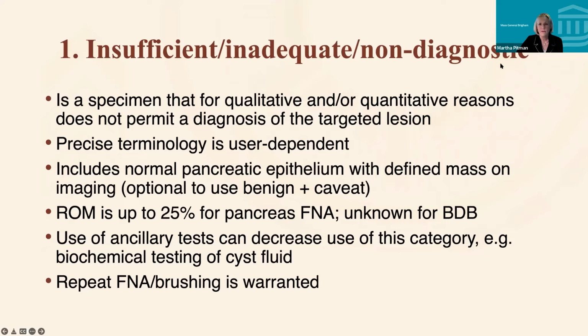And in my lab, we use non-diagnostic because we want to make it very clear that we have a specimen that was processed and evaluated. So we have at least billing information and we can be paid for what we've done, and that we just feel that the information on the slide is not enough to make a diagnosis.